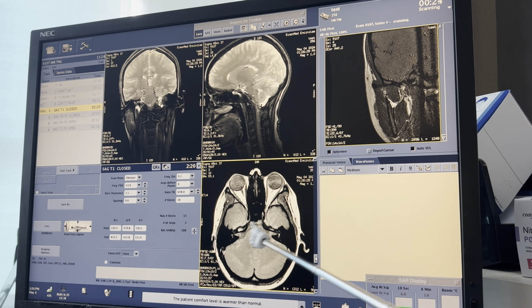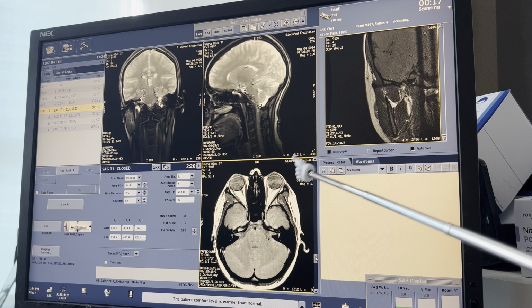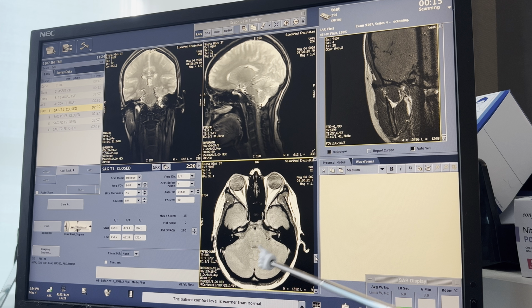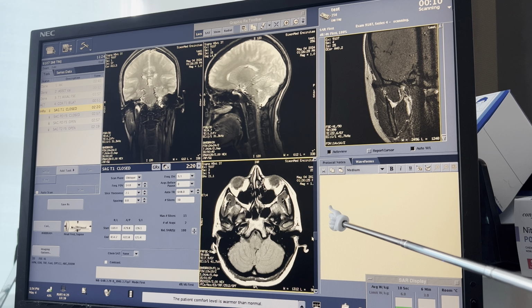Bilaterally, so you can see like the ear. Shrek's ears are the IACs, and so I always kind of look for this image right here if you can't find the IAC, or if you can't find the mandibular condyles, because you know that you're close if you can find this. So let's go up like 3 images. There you go, the beans. Let's go up one more maybe.